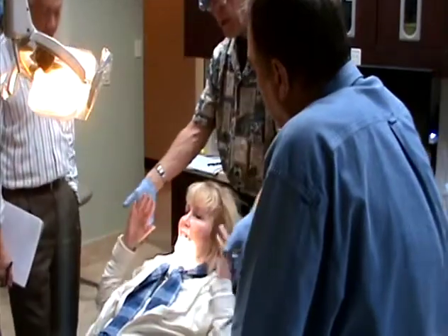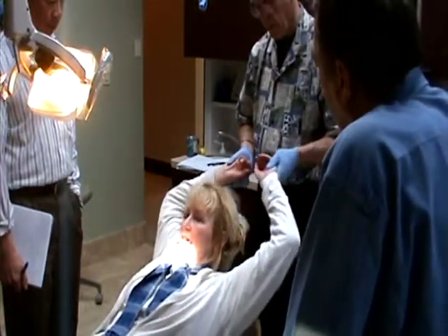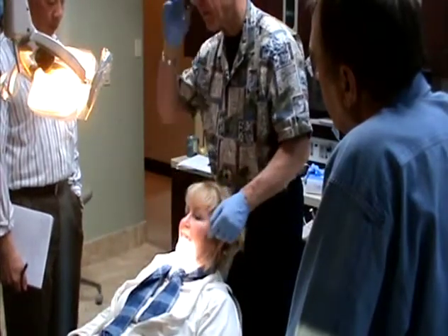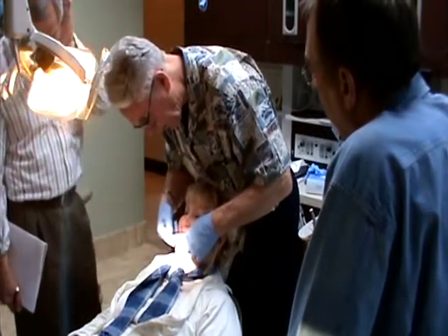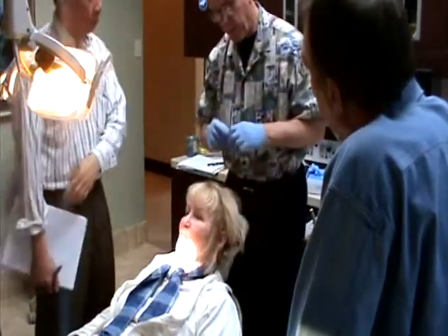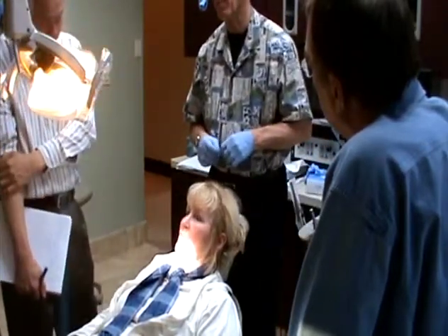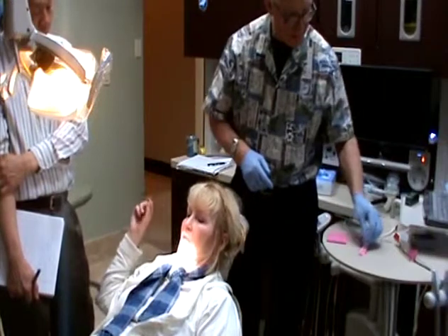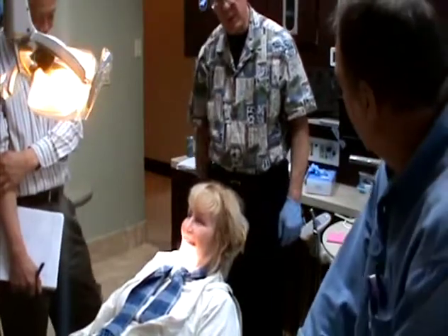In your hands, and just relax like that. Yeah, see, she's at the bottom of her freeway space, but she's actually even a little better up there. Can you feel that? You can feel that, yeah. You're even a little better up there. So for right now, this anterior stuff, you'd be open just a little more. I'd say maybe 4 paper thicknesses, and then you make them kind of wide and flat, so you can slide around on them while you're pulling those teeth up. They're harder to chew on. So she's slightly overclosed even now, just a little. Can I have that paper? Thank you. That's good.